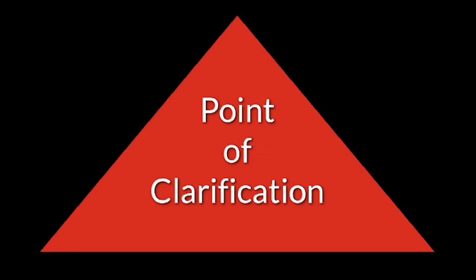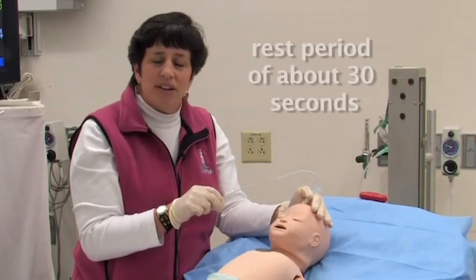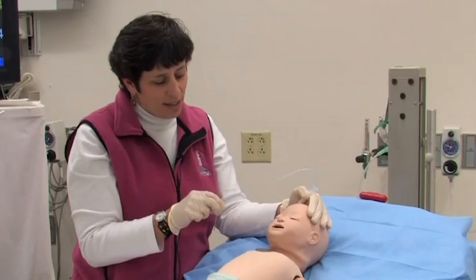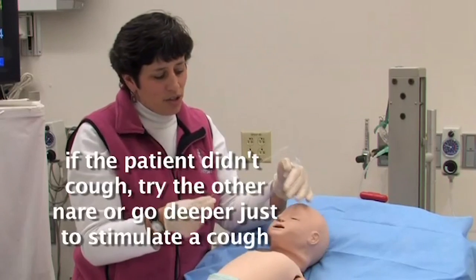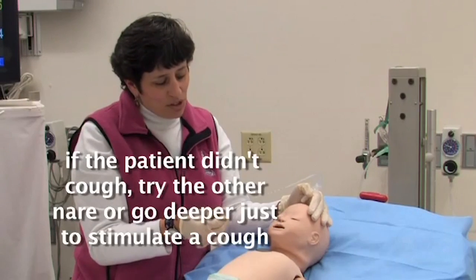Please note that you should limit each suction pass to 3 to 6 seconds. Give the patient a rest period of about 30 seconds to recover before suctioning again. If the patient didn't cough, you might want to try the other nare or go just a little bit deeper to stimulate a cough, if the patient is able to cough.